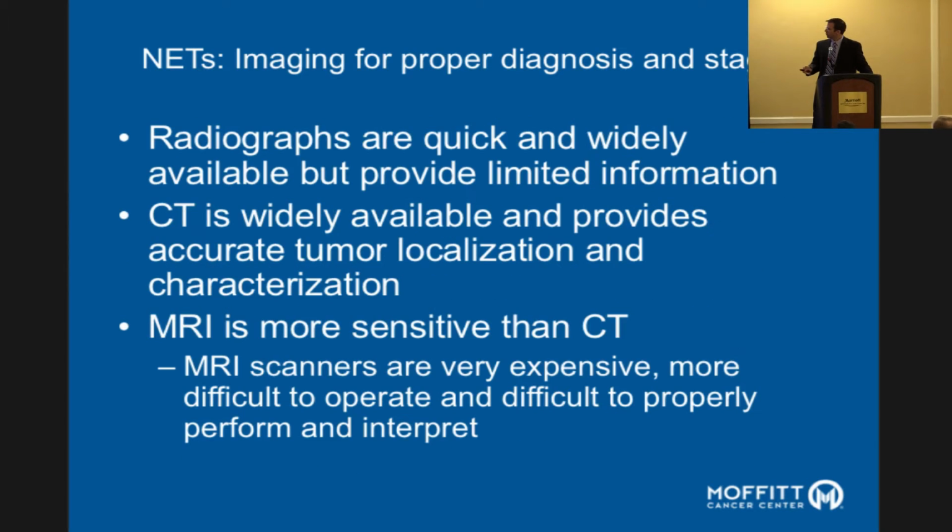So radiographs are widely available, quick, fast, easy to do. CT scan is also widely available now. And the difference between those two is that radiographs are a fraction of the radiation dose of CT scans. So if I'm exposing you to a higher radiation dose, am I getting my money's worth? And the answer is yes.